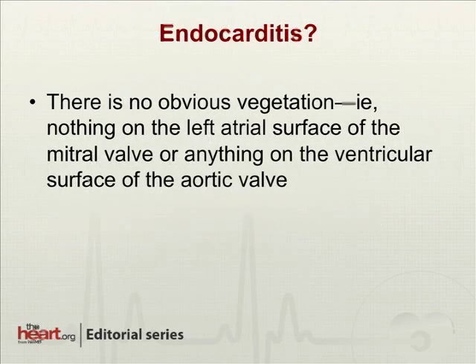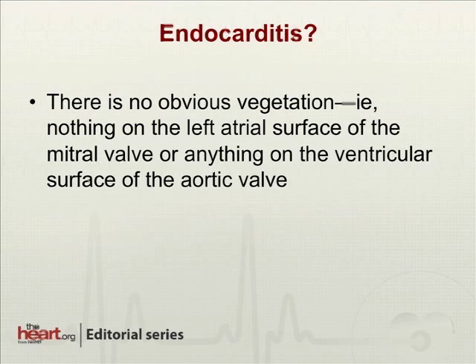Could this be endocarditis? There's no obvious vegetation, even though a transesophageal echo is much more sensitive than a transthoracic echo. However, at least grossly, there does not appear to be anything on the left atrial surface of the mitral valve or on the ventricular surface of the aortic valve where you would usually expect left-sided endocarditis. There's nothing on the right atrial surface of the tricuspid leaflets either.